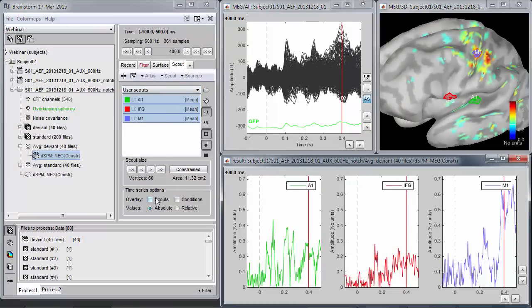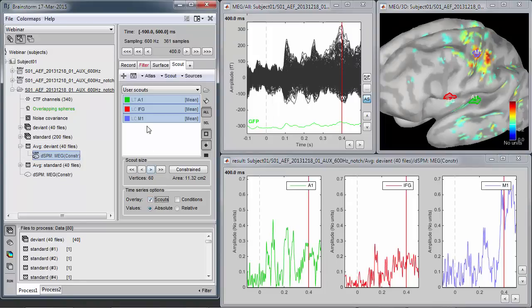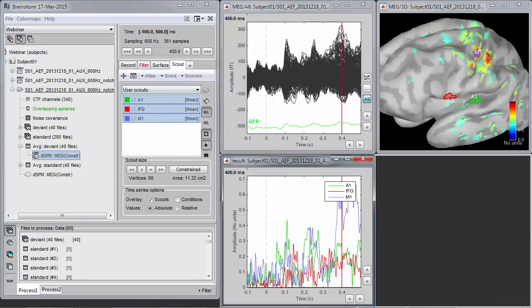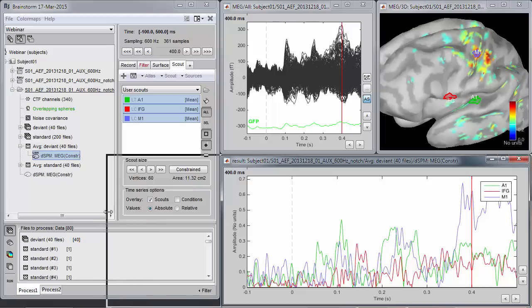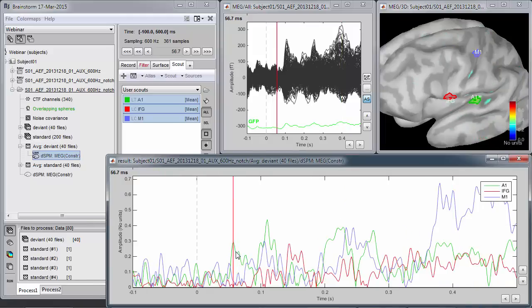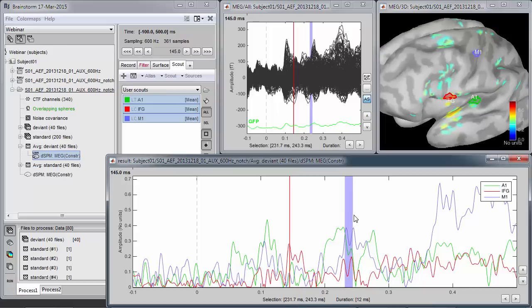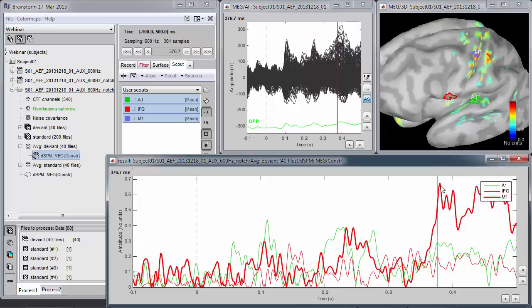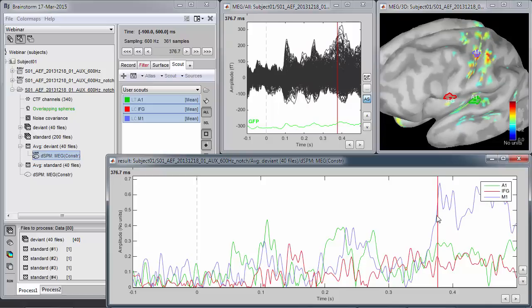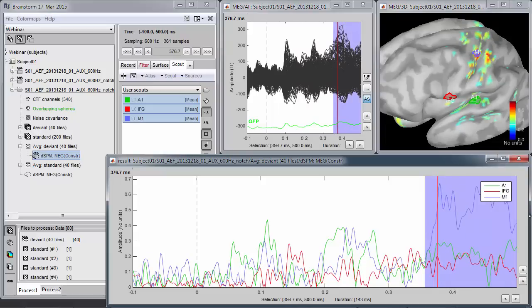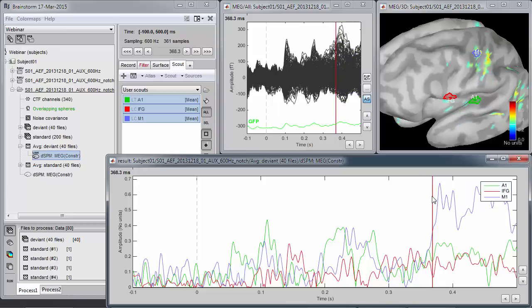I select all three regions and press the oscilloscope button. Now I can review each time series separately, or overlay all three together to better appreciate the chronometry taking place. Around 50 milliseconds is the very early onset of the auditory response. Later by 150 milliseconds is the typical response to deviant tones. And then some complex processing occurs, but you can clearly see that the blue trace from the motor region takes over and becomes very strong — it corresponds to the button press.